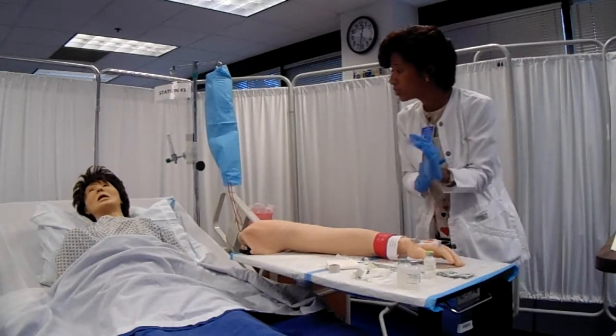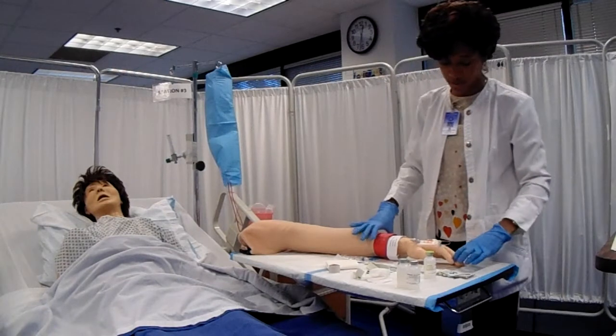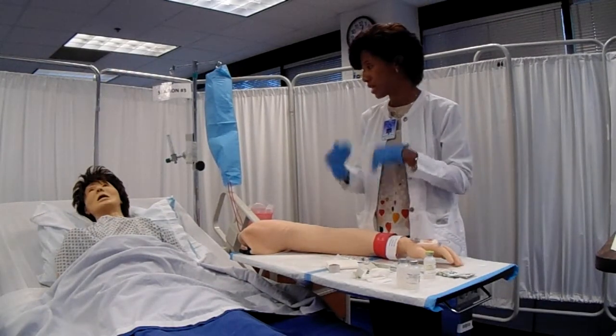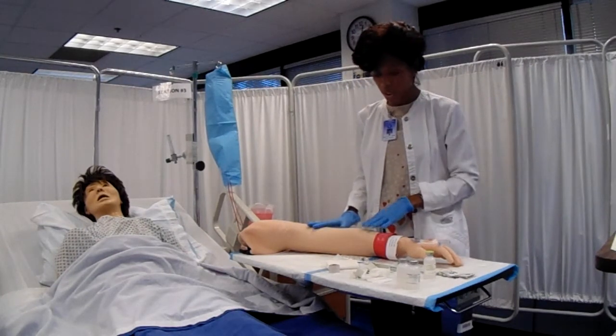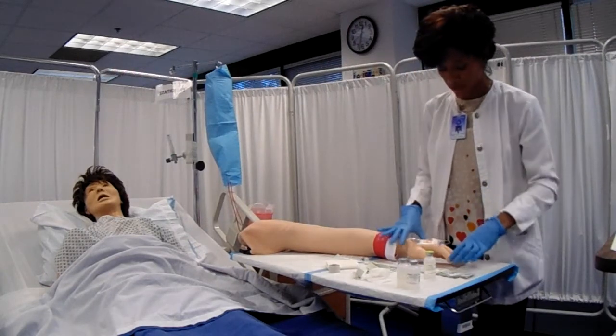I'm sorry, what was that? You take furosemide at home, so you know all of it. Okay, great. So this is not the first time. Well, having it done intravenously, it might take effect quicker than the pills. So if you feel like you need to go to the bathroom right away, just let me know and I'll be here to help.